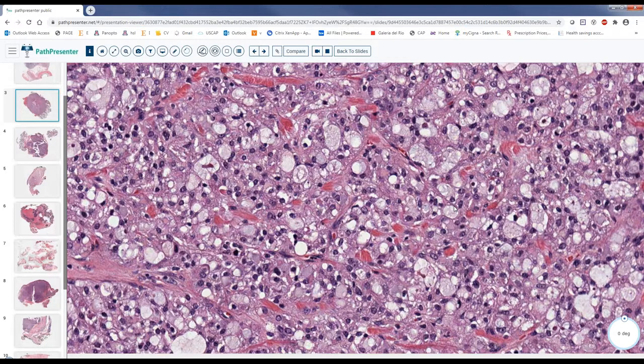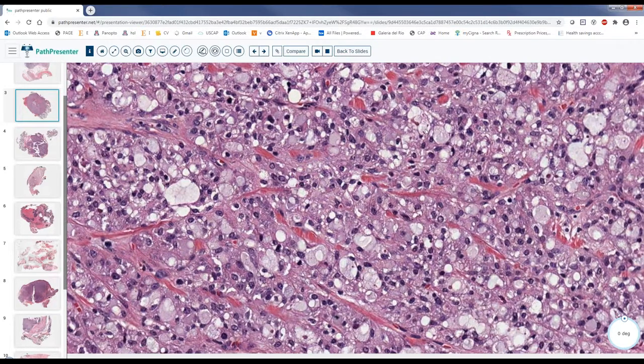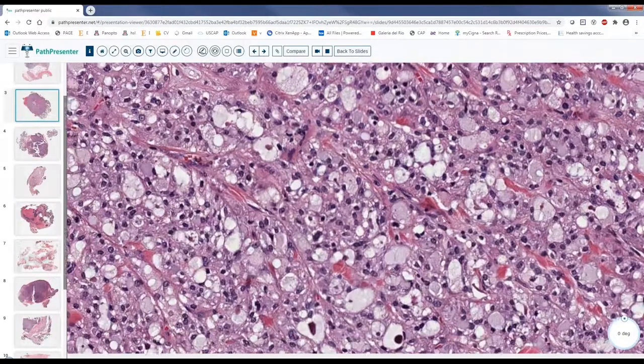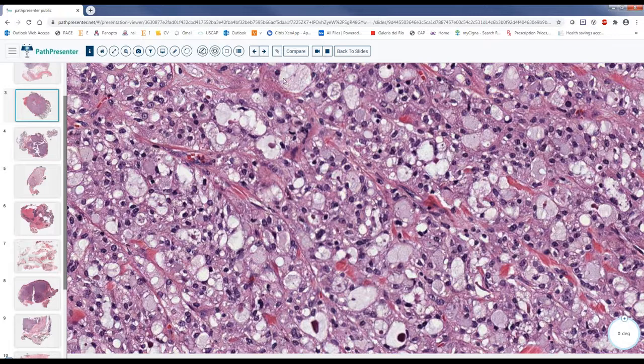Kind of solid versus, well, we have some spaces here, so I would go with acinar, maybe cystic areas. I agree with that. What are the cells themselves like? Are they pleomorphic or monomorphic? I don't see much pleomorphism; they look alike. Okay, good. I don't see mitosis or necrosis. They look all similar. I see some material in these spaces.